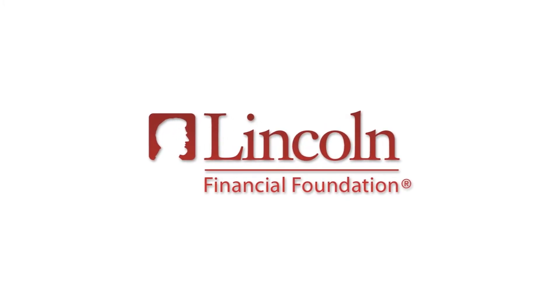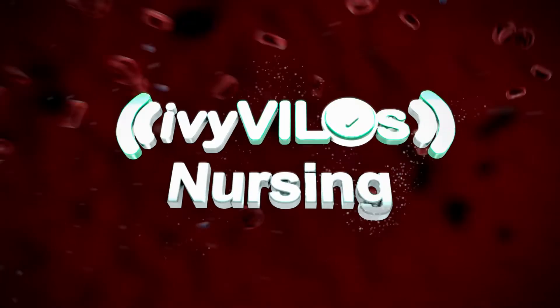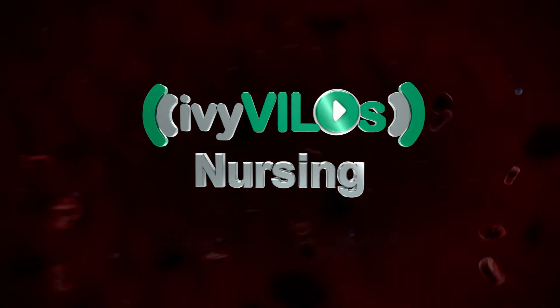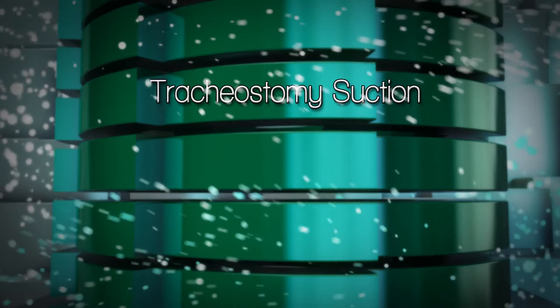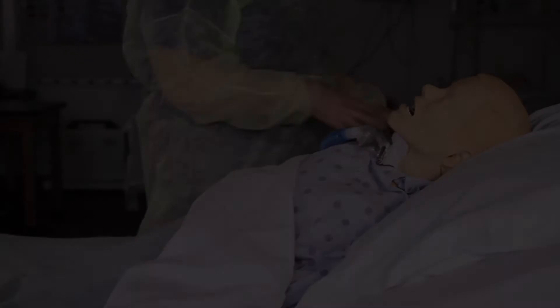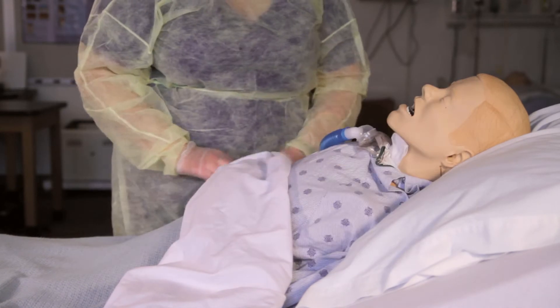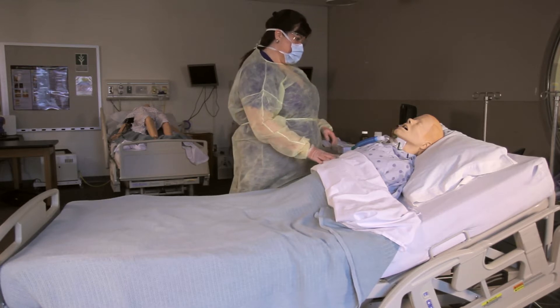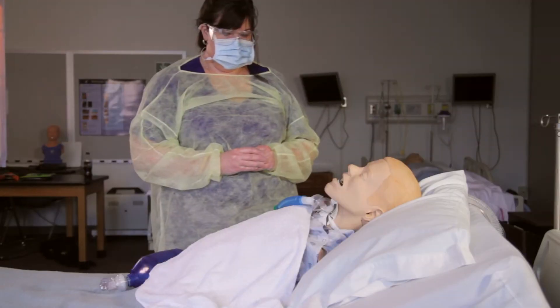The following has been made possible with a grant from the Lincoln Financial Foundation. Trach suction. Review the physician's order. Check the patient's identification band. Ask for their name and birth date. Provide privacy. Explain the procedure.